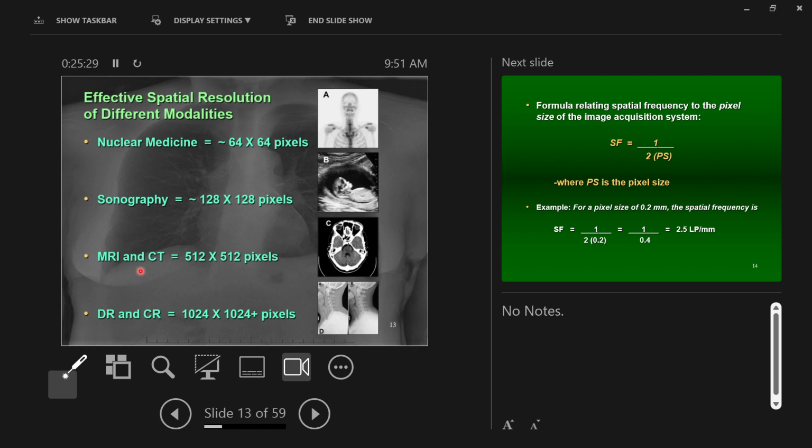And another good example would be, and I'm getting off track a little bit, but it's okay, somebody is suspected to have had a stroke, a brain bleed, right? And MRI would give us the best information about it, but MRIs take a long time to actually take the image, 45 minutes or whatever, right? Take the many images that they can make, and the patient has to keep still for that time. If it's a life-threatening emergency, we can't take the time to run them through the MRI machine, right?